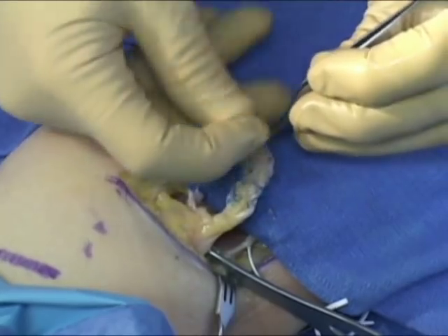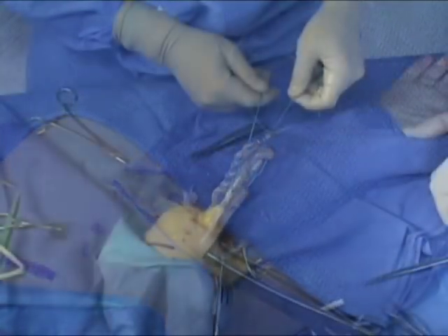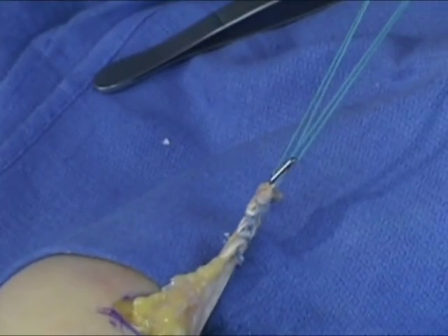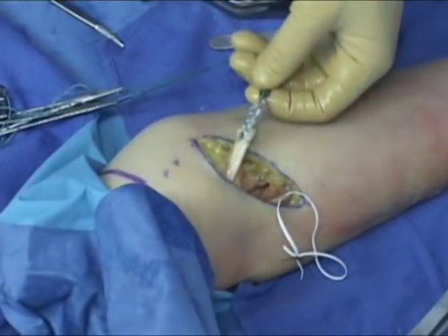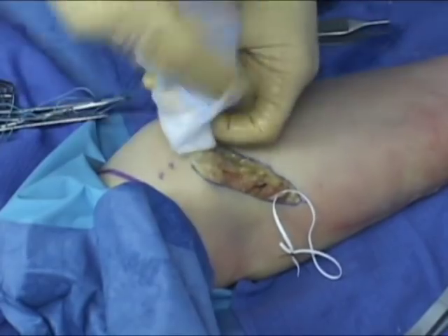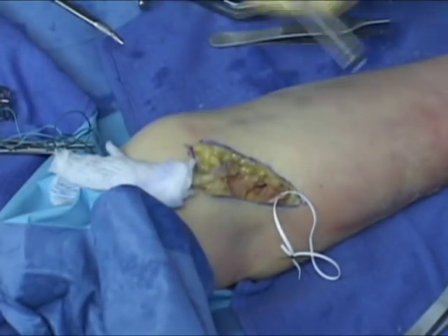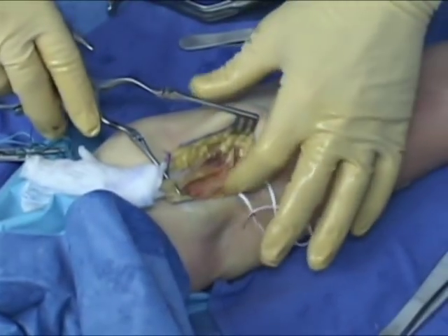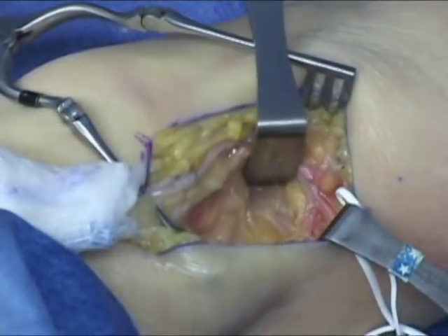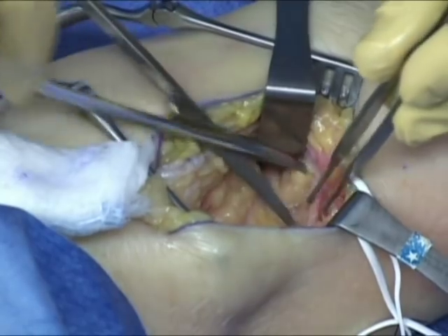Zero ethibond marionette sutures are then placed to help toggle the endobutton. Preparation of the tendon is completed and it is wrapped in a moist sponge for later use. The entire tendon is reflected proximally while the tunnel is then again exposed. Blunt dissection is carried out down to the biceps tuberosity and a curved cobra retractor is placed about the ulnar side of the radius to protect the medial neurovascular structures.